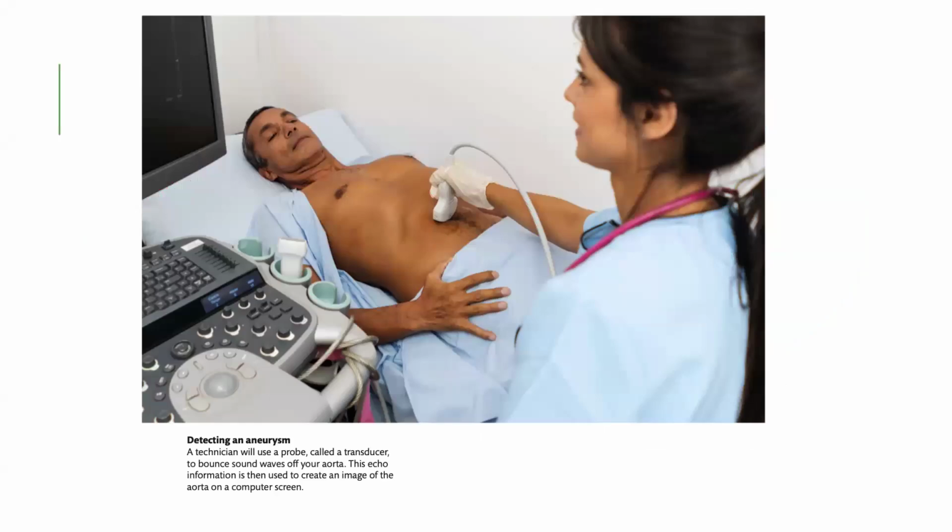A technician will use a probe called a transducer to bounce sound waves off your aorta. This echo information is then used to create an image of the aorta on a computer screen.